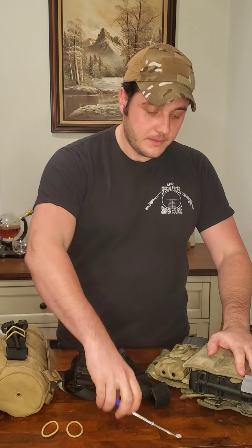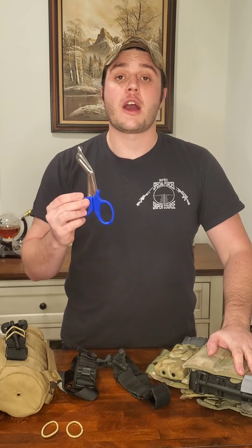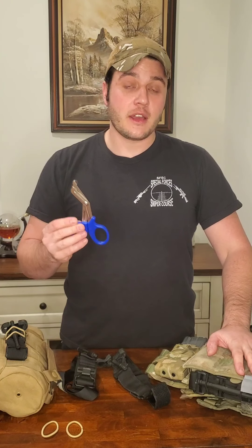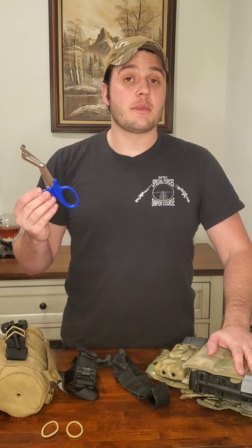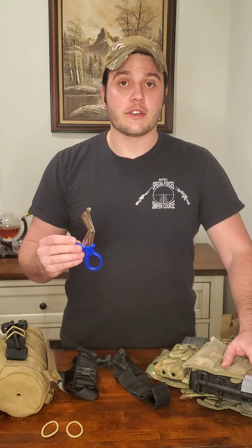One more thing: exposing and identifying the wound. I suggest carrying a pair of trauma shears, because characterizing where that wound is tells you where to put the tourniquet. If you don't have them and you come up on somebody who's injured, that's fine — don't worry about it. Seconds matter. Get the tourniquet on, get it high and tight, then remove the clothing to expose the injury and adjust from there.